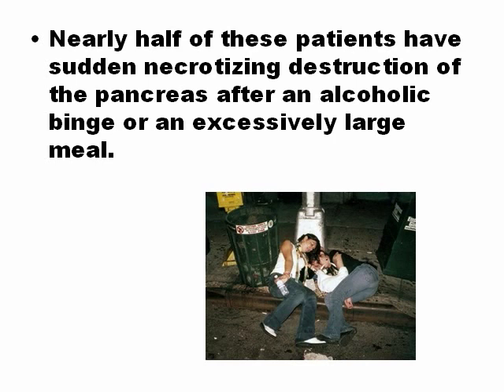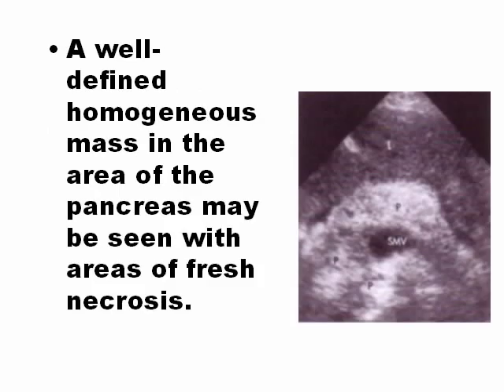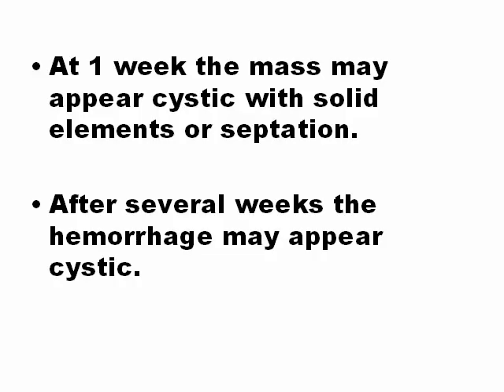Nearly half of patients with acute pancreatitis have an episode after an alcoholic binge or an excessively large meal. A specific sonographic finding depends on the age of the hemorrhage. A well-defined mass can be seen at the beginning of necrosis — you can see here the echogenic area that is the beginning of the necrosis. At one week the mass may appear cystic with solid elements, like a complex cyst. After several weeks the hemorrhage may appear totally cystic.